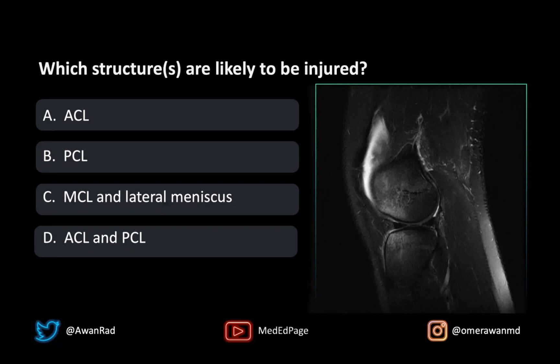If you notice on the image, there's bone marrow edema involving predominantly the anterior femoral condyle and the anterior tibial plateau. This should suggest a hyperextension injury mechanism.